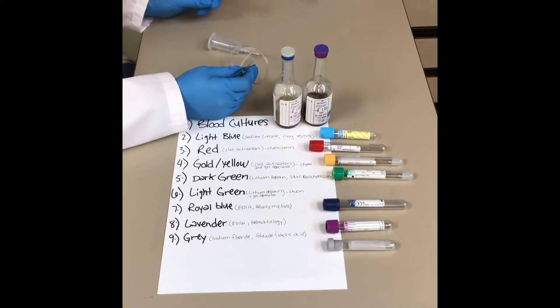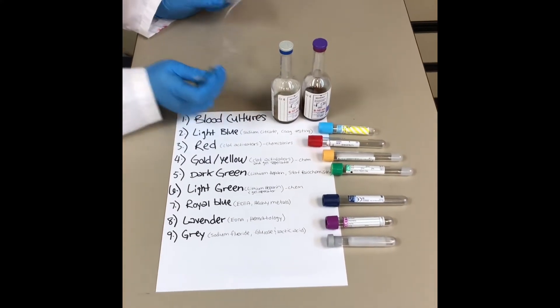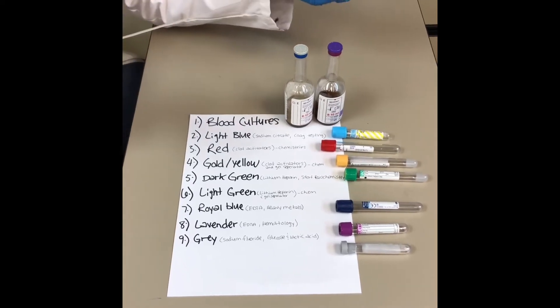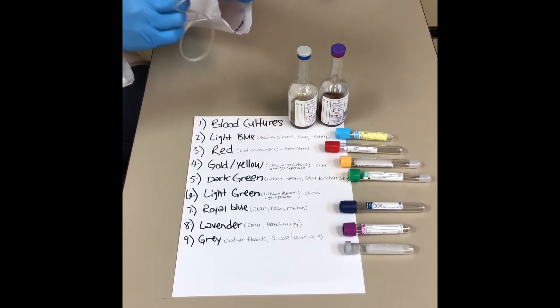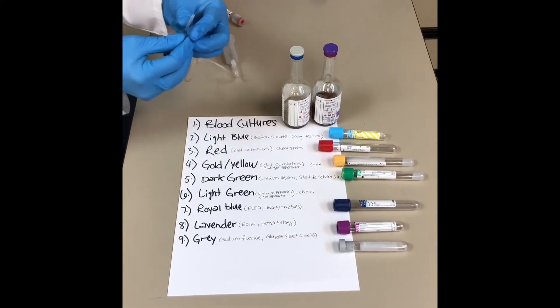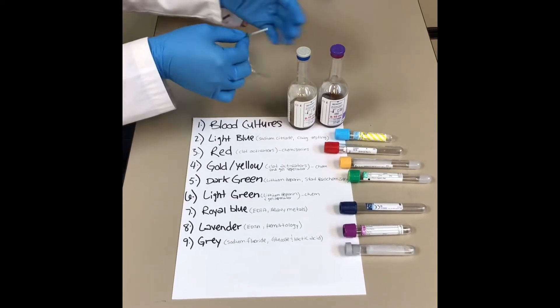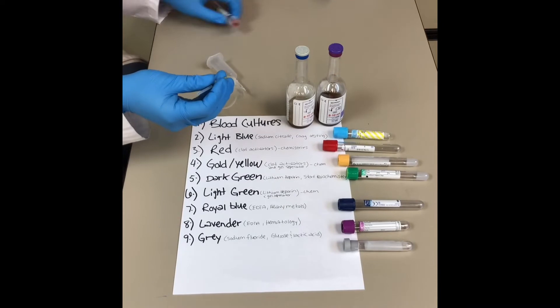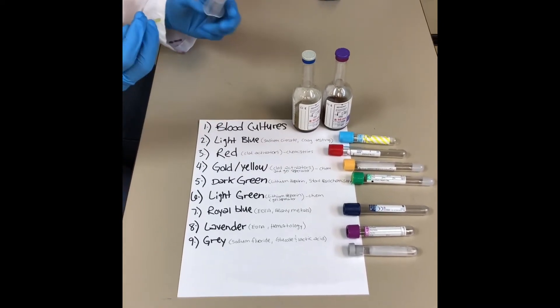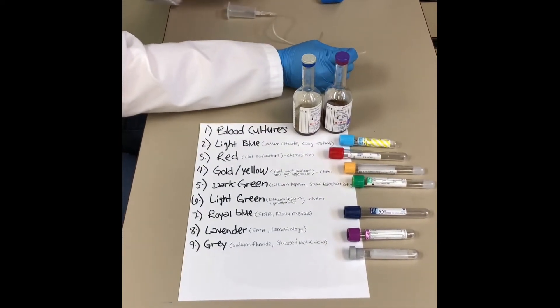Today we're talking about the difference between the vacutainer phlebotomy method and the butterfly method. One of the main differences is that it has tubing instead of the needle just being attached to the hub. A lot of people like the butterfly a little bit better because it has wings that allow you to easily maneuver into the patient's arm, and the tubing helps with putting the tubes in place — it's not as difficult, and you don't have to worry about wiggling as much.